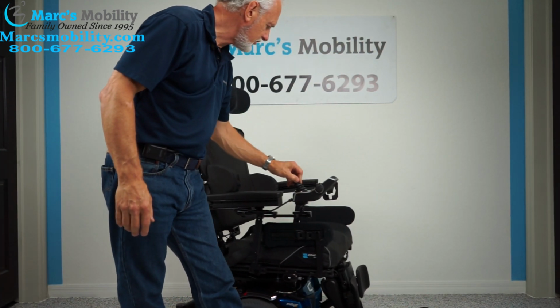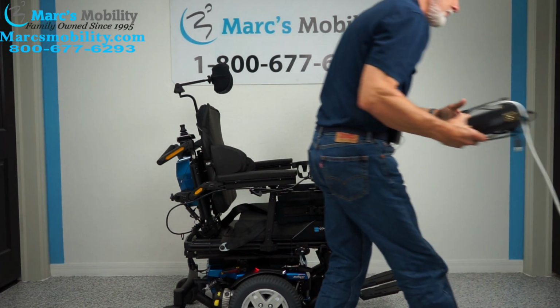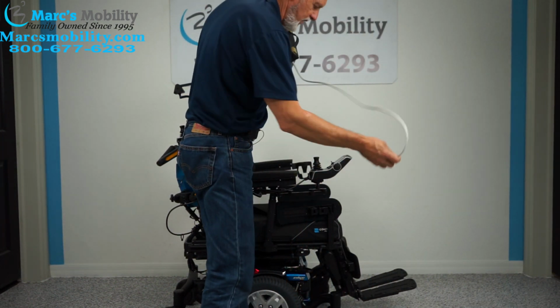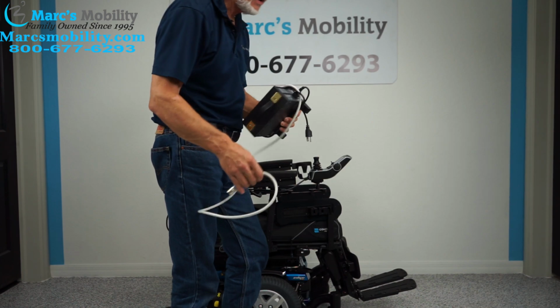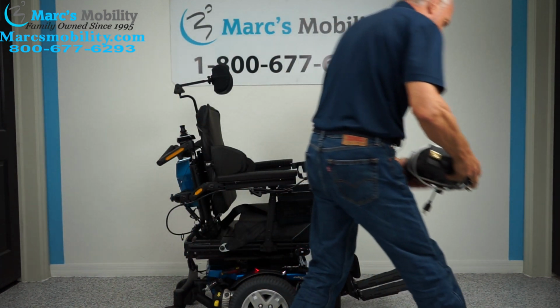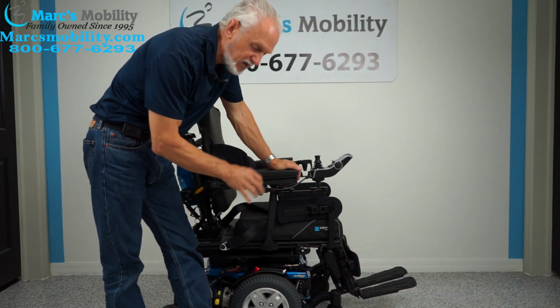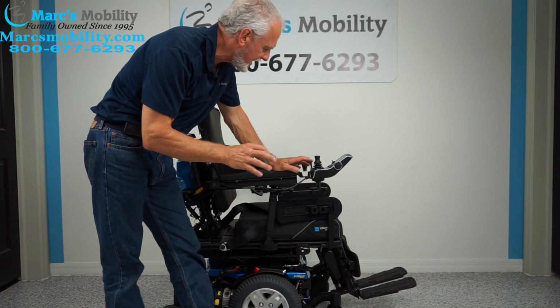I think I've covered everything on the chair so far. When you charge this chair, you'll take your charger and you'll plug it right below your joystick right here. And as soon as the light goes from orange to green, the charger will stop charging. This chair has two big batteries in here. They're 75 amp batteries. They're really big batteries.